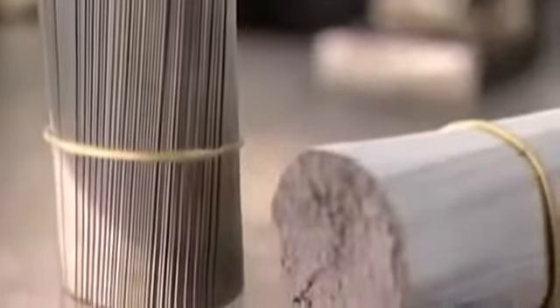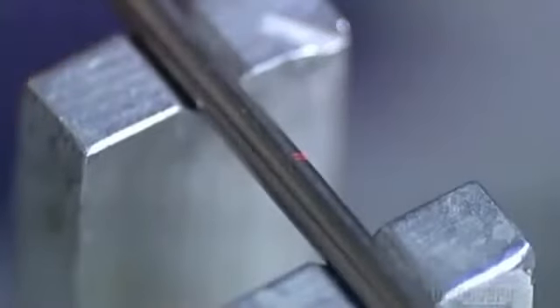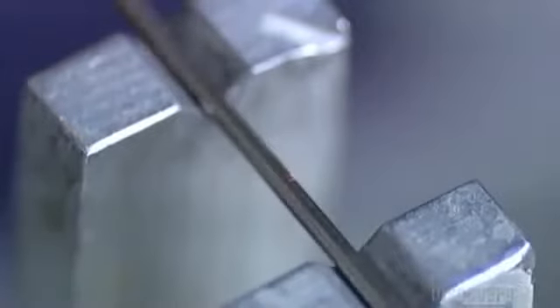An operator bundles them together with a plastic band but removes a few to check the specs. A micrometer uses laser light to measure the outside diameter. The tube is supposed to be two millimeters, and it's right on.